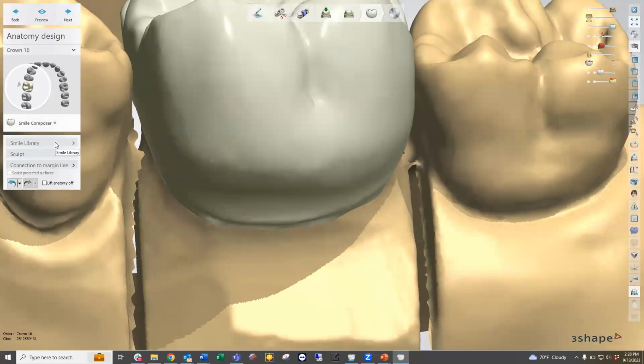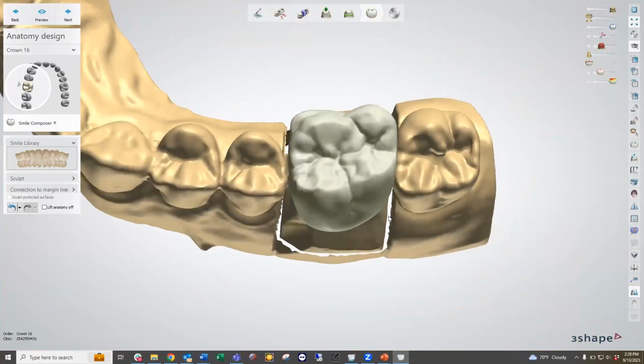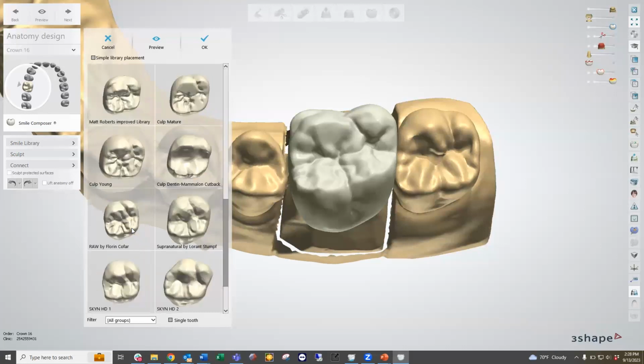Under the Smile Composer, we have the Smile Library, which allows us to choose the library of the unit that we're going to be using. So if we didn't like the look of this occlusal attrition, we can choose from the various libraries available to us, and we can choose one with either more or less occlusal attrition. You can change it to whatever you would like.